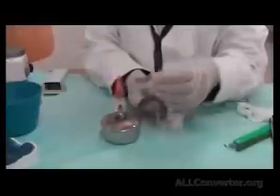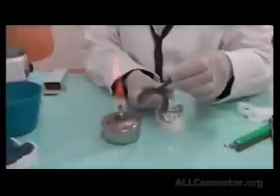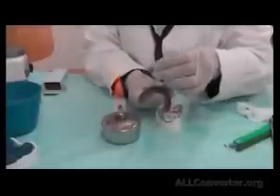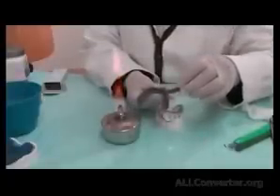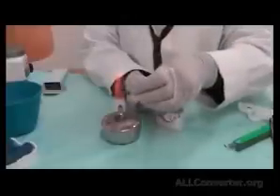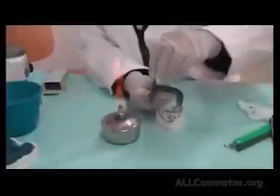Tempering, adding the first layer, which acts as a glue. Once it stops sticking, I stop adding. I would consider this a glue area. Stop sticking, stop adding. And this time I'm going to do larger sections. That's because you have understood the idea. But what will differ here are what we will be doing to the patient while we're doing the border molding.